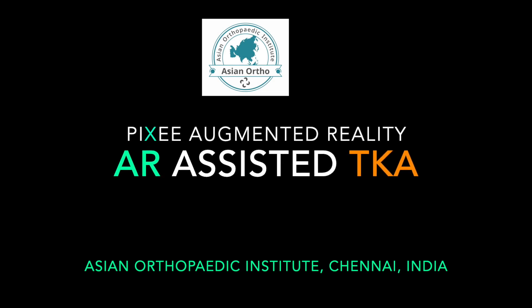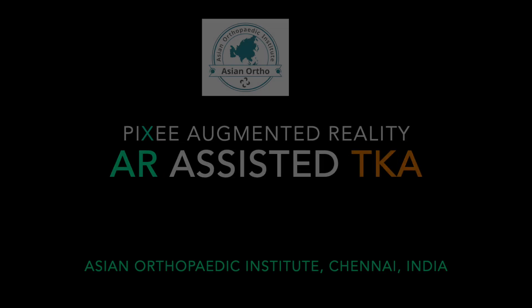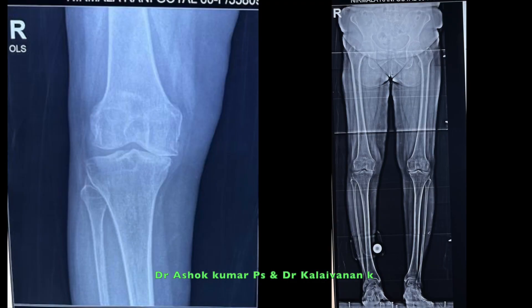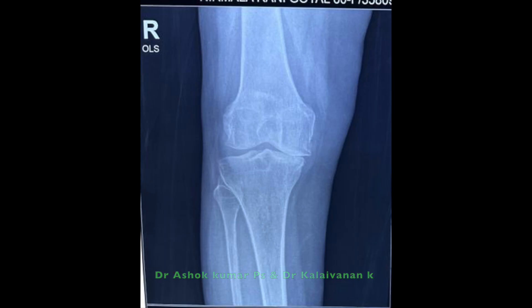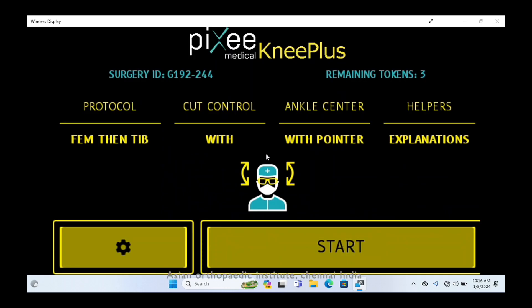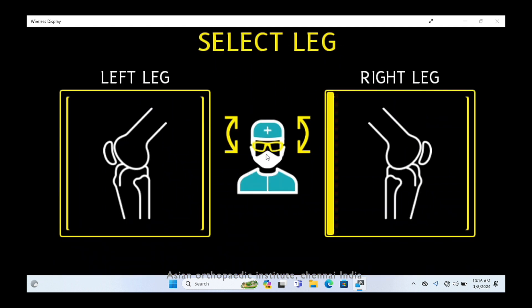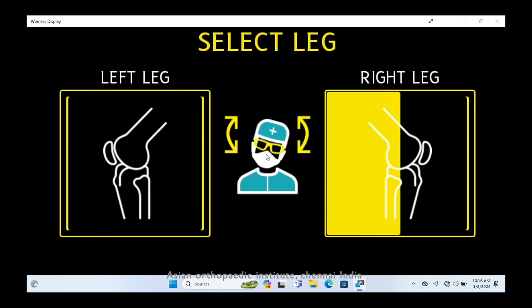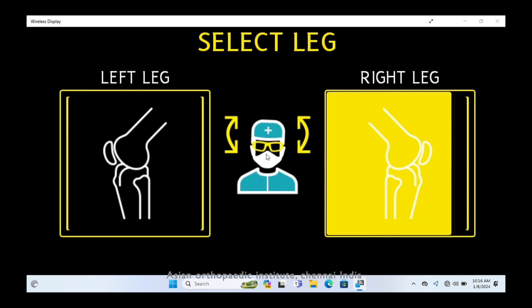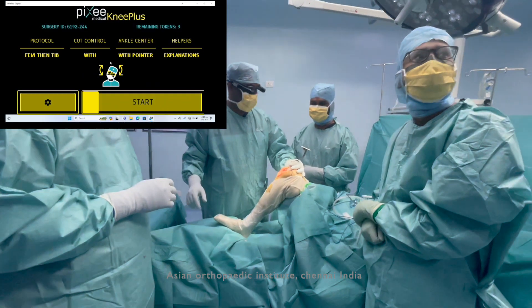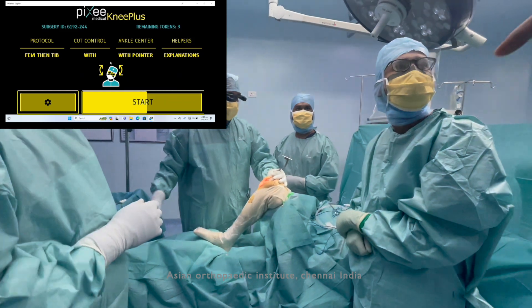This video demonstrates augmented reality assisted total knee arthroplasty. Using augmented reality, a surgeon wears AR specs and using head movements can choose right or left side.